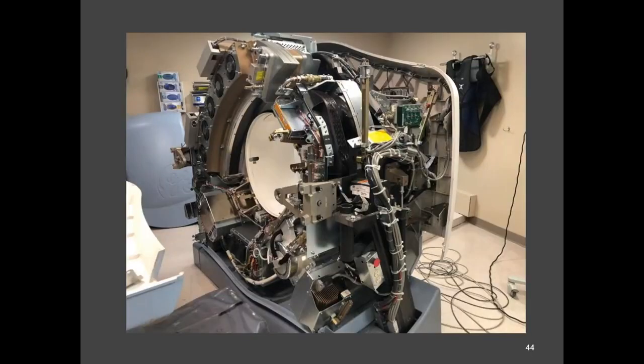And here's the inner workings of the CT. This guy lost his heat exchanger, and that's this big dude right here. So the heat exchanger quit working, and the oil to the x-ray tube. So if you haven't seen the inside of a CT scan, that's what that is. And it does do cases as well.